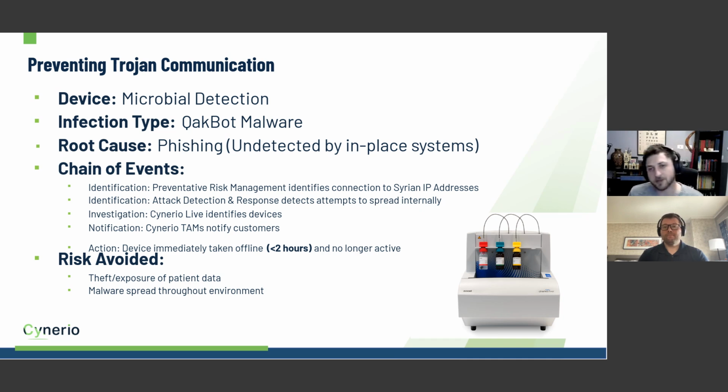We actually noticed it because the device tried to connect to a Syrian IP address or a number of Syrian IP addresses. Always sort of a red flag, right? Medical devices typically don't need that as part of their standard operations. And that indication was concurrent with the other indication that I was talking about, which is that the device was more talkative than we would expect, and the additional traffic did look strange.